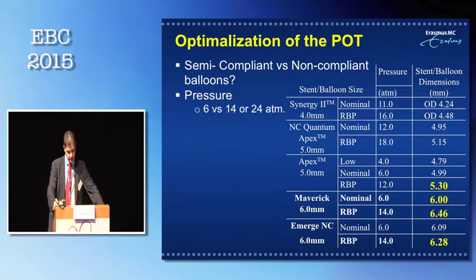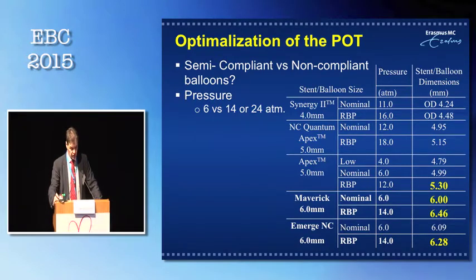This is ellipticity for the stents, all above 1 in the combination of final kissing balloons. So the conclusion was that adequate sizes are necessary. In principle, you really need a 4.0 and 5.0 to get the correct area. The pressures are necessary to get sufficiently high pressures, but still you might end up in serious ellipticity.